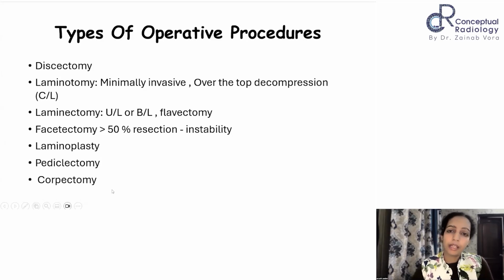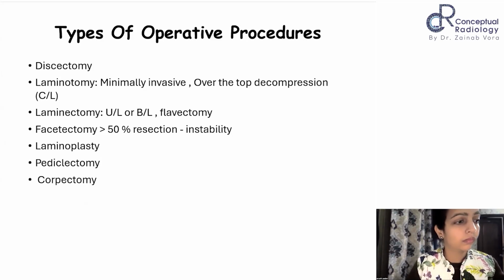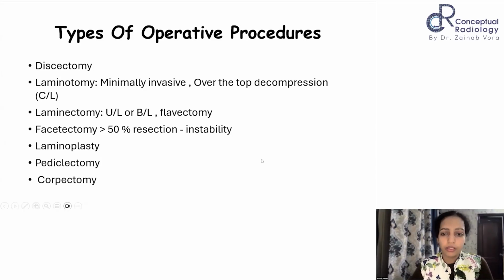And what is corpectomy? Anybody? The name is not very suggestive, and that's why I'm asking. What is corpectomy? Come on, guys. Yes, so vertebral body removal is corpectomy, right? Which one are you asking? Last point ones, which one? Tell me, quickly, say which one?